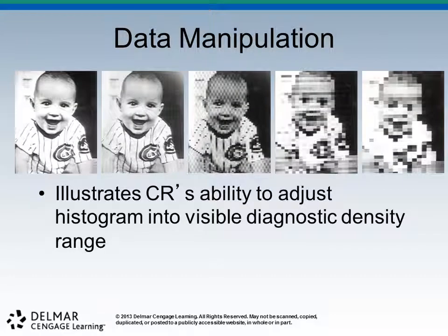All right, so here we can take this data here. Young Eric Carlton, the Cubs fan, bless his heart, poor kid, and we can change it, right? This ability to make our histogram into some sort of really nice radiograph. What we're doing here, this is pixelated or blocky. This is almost World of Warcraft stuff, somebody said the other day.